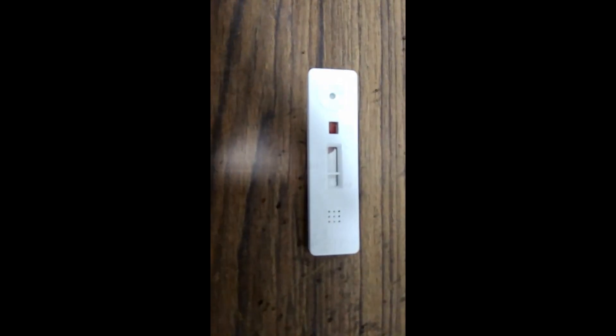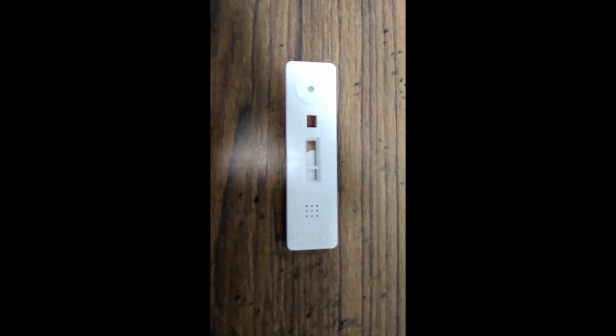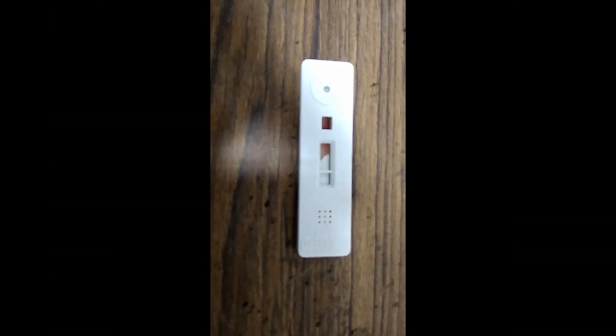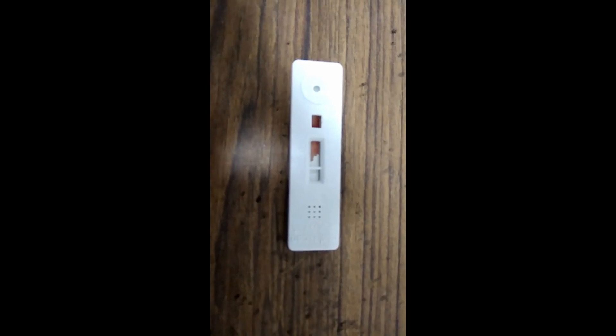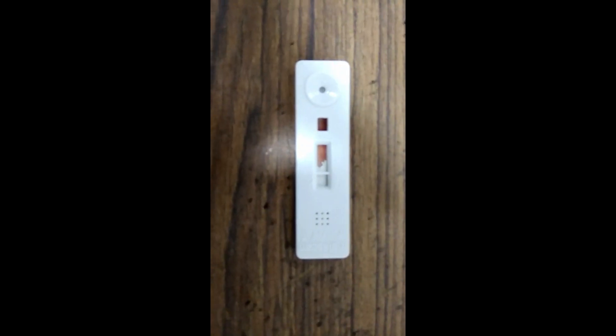Finally, read the result at the end of 20 minutes. The Malay Scan Rapid Test for Malaria PF/Pan device is a product of Tulip Diagnostics. Sensitivity and specificity is 100 percent.